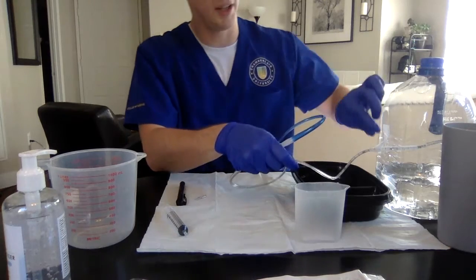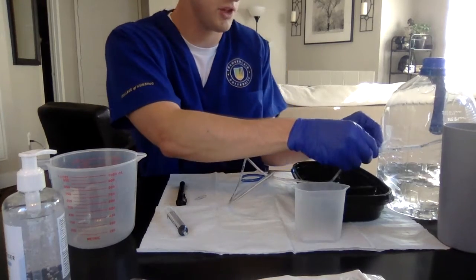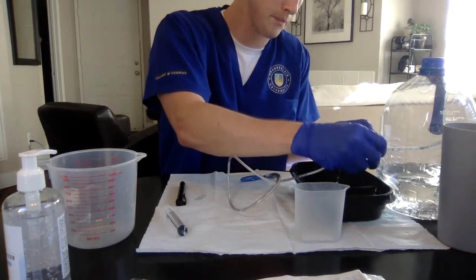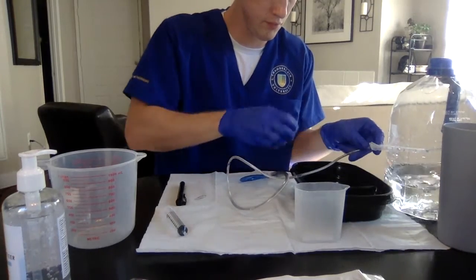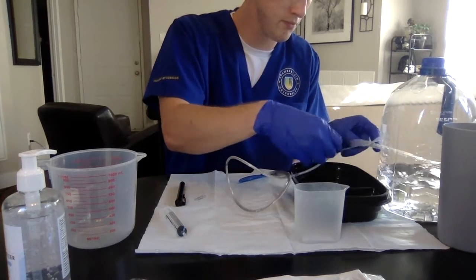We're going to remove the tape from our, set this down for a second. We're going to remove the tape here. If this wants to come off for me.